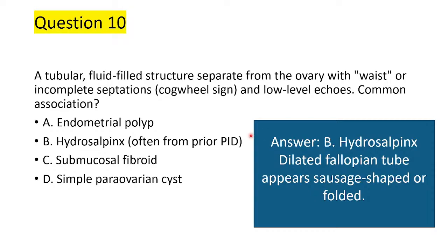So, ladies and gentlemen, this brings us to the end of our presentation on the quiz answers and their explanations, so you can understand that as a sonographer, you need to have an appreciation of the different pathologies and how they look, even without seeing the image. You must have that in the back of your mind.